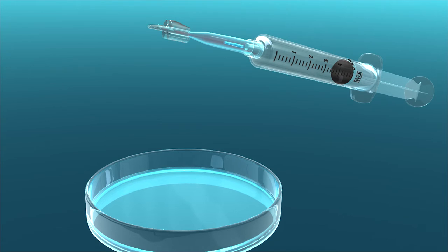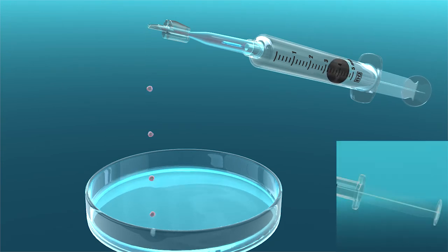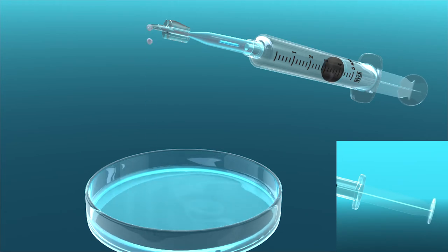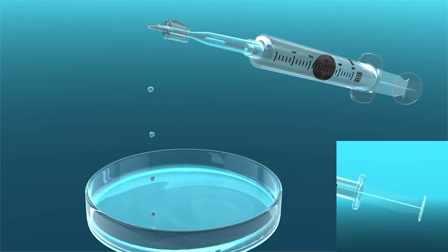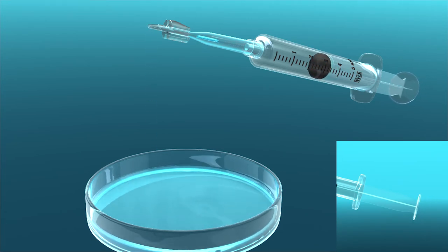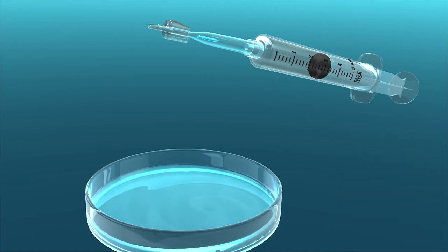Carefully flush corneal storage media from the cannula by using gentle bursts of BSS from the syringe. To prevent the graft from prematurely entering the slender end of the cannula, do not introduce BSS too quickly or forcefully.